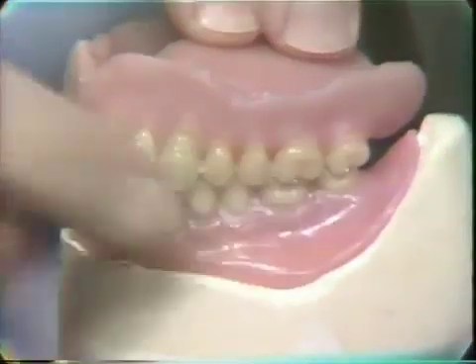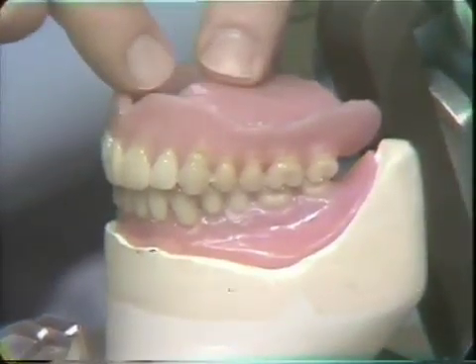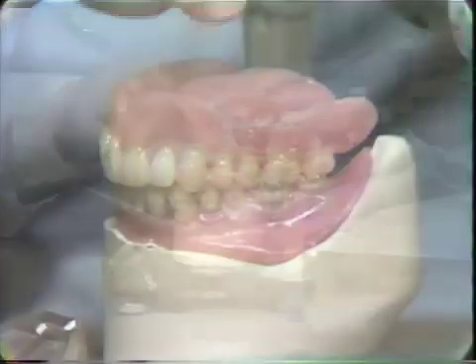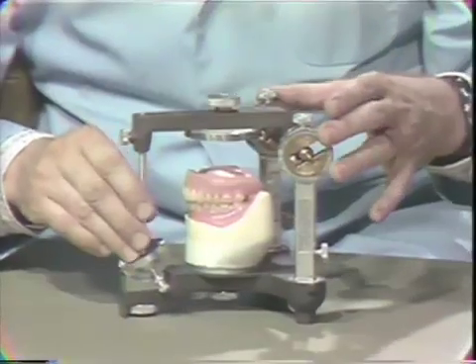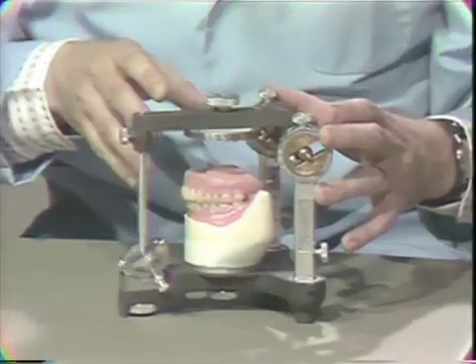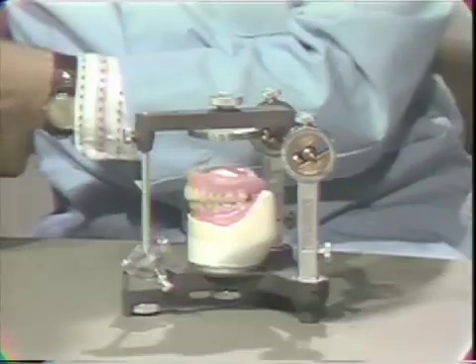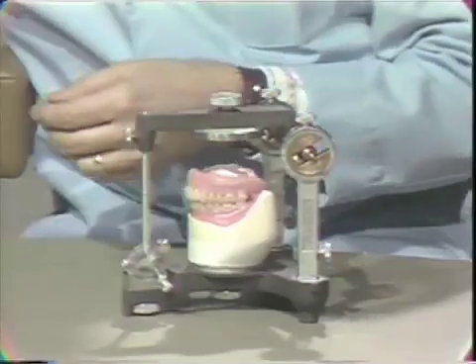We will lute these together with sticky wax, remove the undercut in the upper part of the denture with some block out — I'll show you that in a moment — and then go through the step just demonstrated. Putting a new ring on top of the articulator and impression plaster, close it down, and we have re-established a mounting on the articulator in the relationship that they were in when we set the teeth.